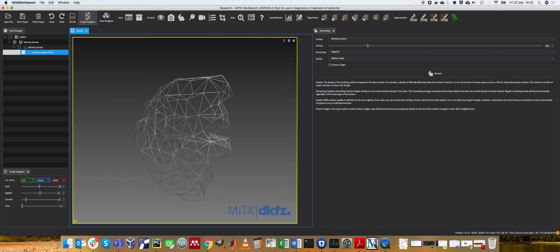So the kind of things that we'll be doing when you're doing surface-based registration is firstly taking some imaging data, secondly outlining it or painting the pixels in some way, thirdly converting it to a triangle mesh, and that would use something called the marching cubes algorithm. Fourthly, a combination of decimation, as it's called. So decimation refers to reducing the number of triangles, and fifthly, smoothing. So you often want to get rid of rough edges, but in one sense that is purely for aesthetic purposes.